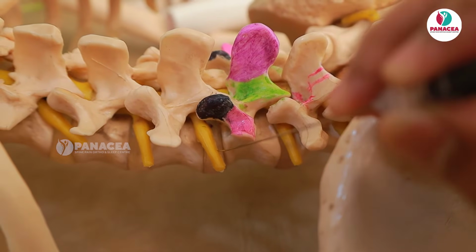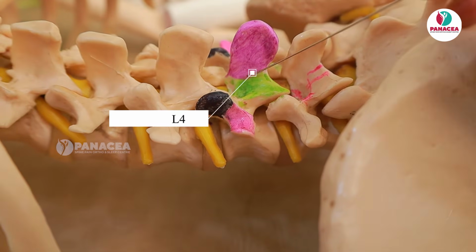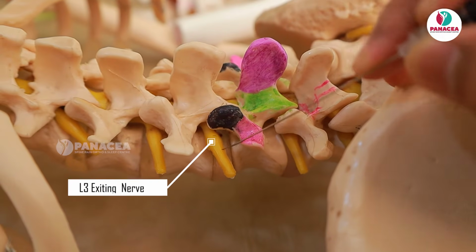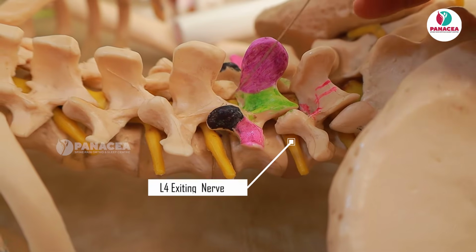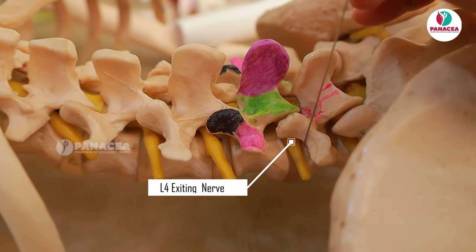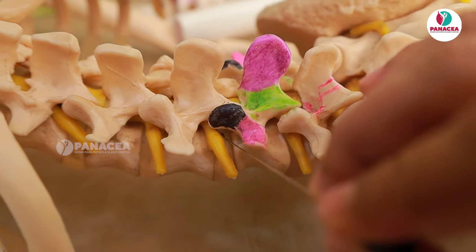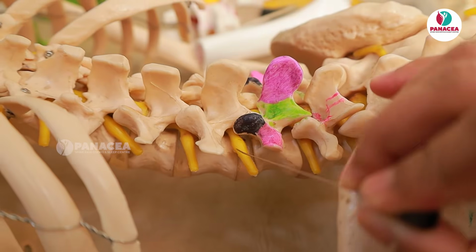For example, if you presume this is the L3-L4 space, then this becomes the L3 exiting nerve root, and here comes the L4 traversing nerve root, which comes under the L4 pedicle. So you will land somewhere here. So if you look at here, the boundaries of the foramina.